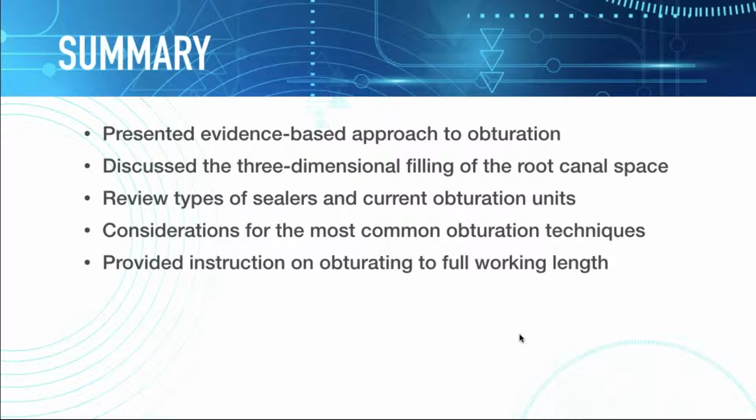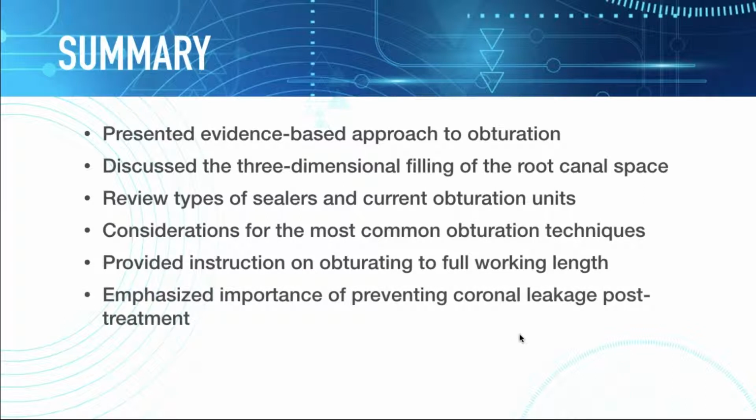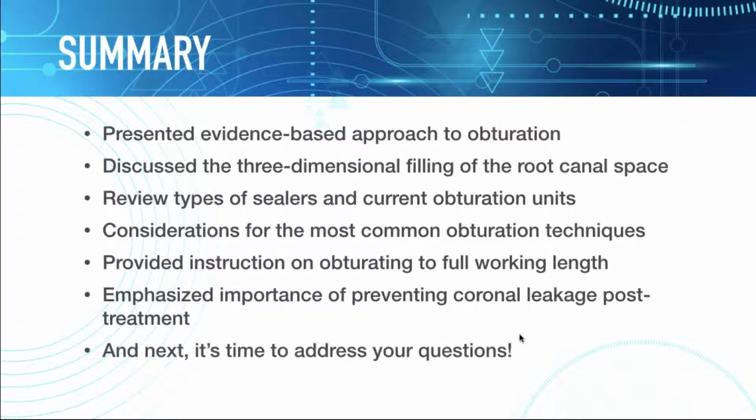Provided you with a step-by-step instruction on how to obturate to full working length, and the ability to go on my website and review the animation that I showed you. And of course, emphasizing the importance of coronal leakage on post-treatment endodontics. And we have to restore that tooth as quickly and as effectively as we possibly can.